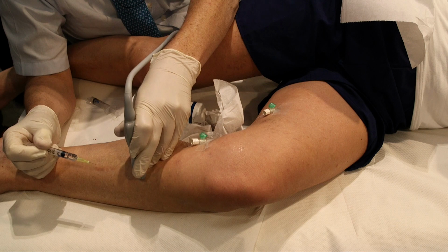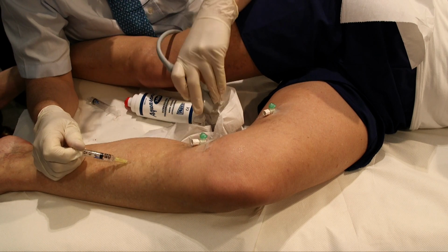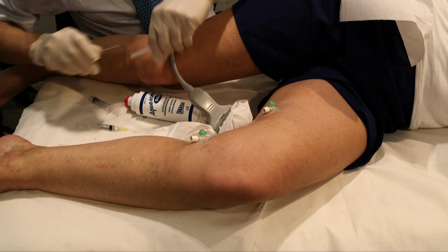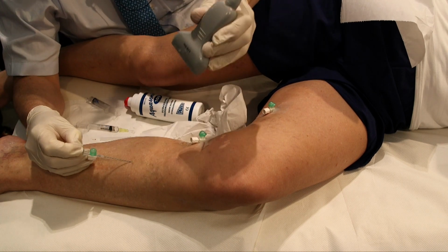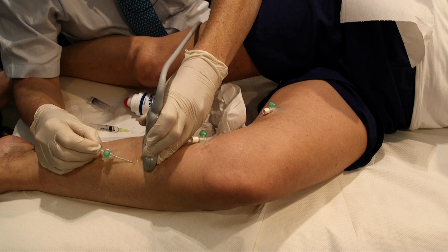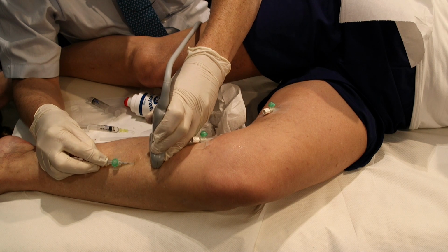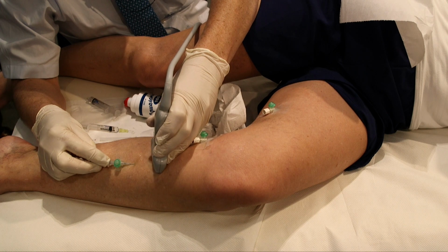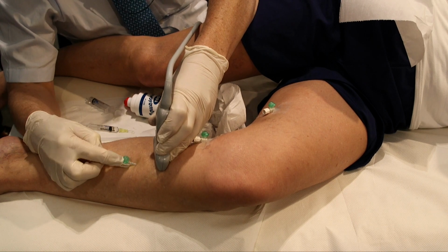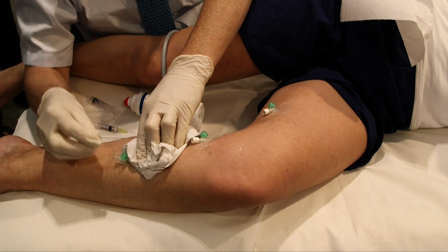So what I'd like to do, with another little injection here, is put a cannula in somewhere near the junction of the tributary or varicose veins with the saphenous trunk, so that when we inject the saphenous trunk, the foam will go into the varices. The converse strategy doesn't work. That was really Professor Fegan's strategy: inject the varices and the trunk remains intact and carries on and creates more varicose veins after a short while. So you always have to put the foam into the saphenous vein. So there's my cannula disappearing into the saphenous vein. But I haven't forgotten about the accessory veins, which we'll treat in a minute.